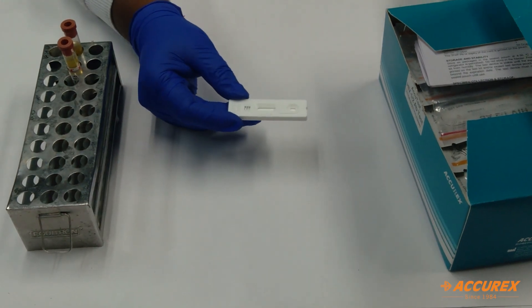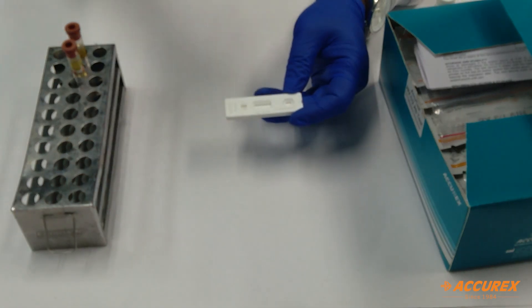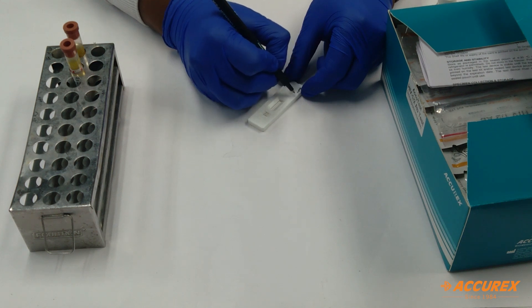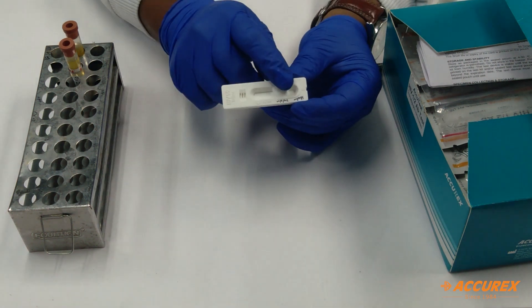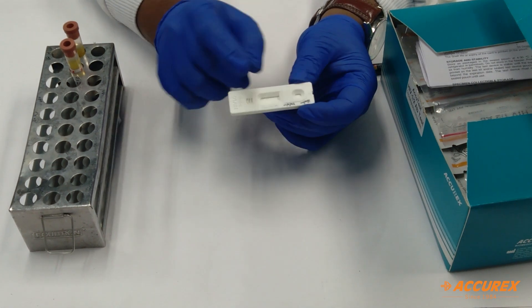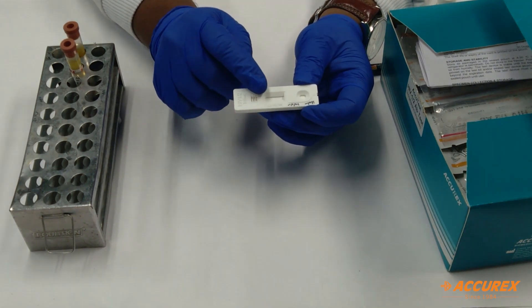Before doing the testing, always write the specimen name, patient ID, and today's date on the card. On the test card, you can see there is a sample well where you need to add the sample plus buffer. Here you will get the result — HIV-1 line, HIV-2 line, and a control line.